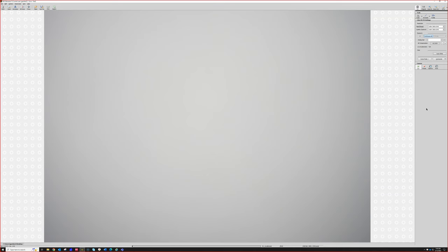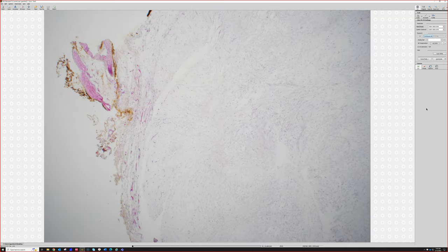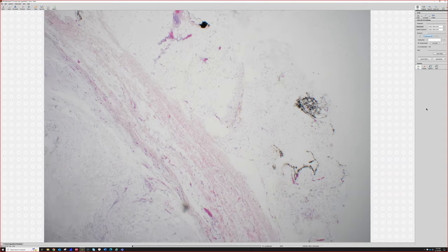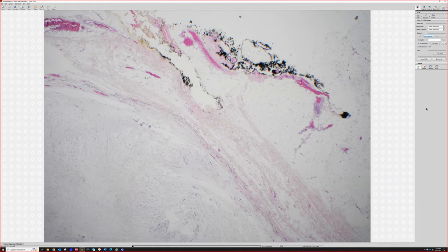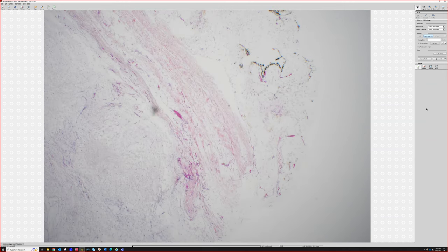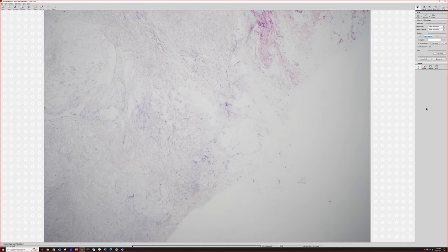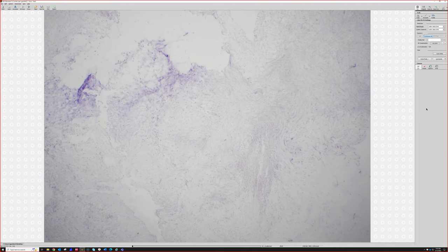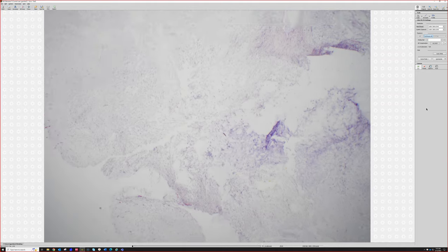So no epidermis, right? It's not fair. This is supposed to be a dermpath session. Well, when we have a nodule with no epidermis on it, and we may have nothing around it or a little fat around it, it means we're in the subcutis, right? If it's something that came from an outpatient clinic, if you can get it out without anything attached or with a little fat attached, that means it's probably a subcutaneous based nodule or deep dermal nodule that's pushed into the subcutis. If it's deeper than that, you're going to have some muscle with it or something. So any ideas for what to do with this thing?